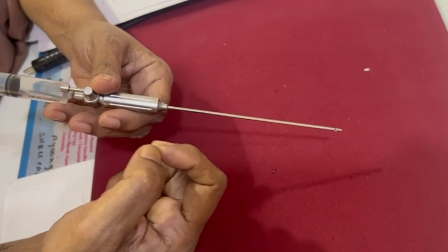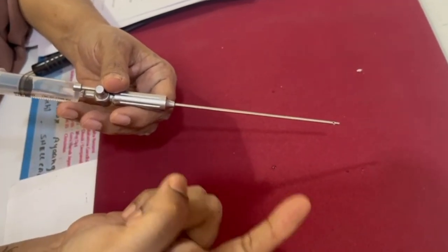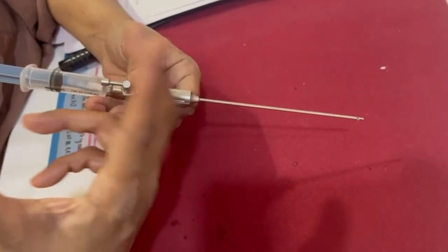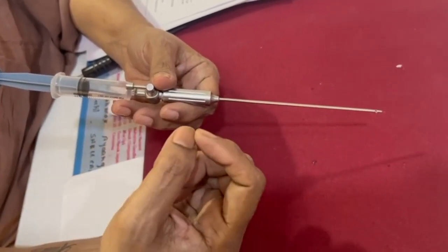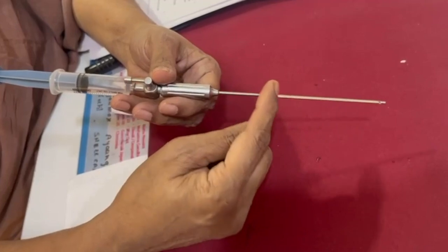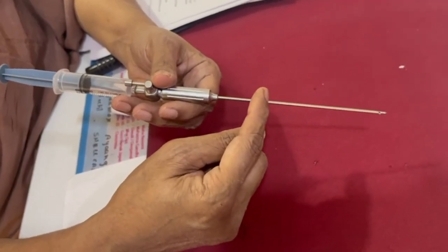Suppose you aspirate blood, that means you have injured a vessel. Suppose you aspirate yellowish fluid, that means you have perforated the bowel. That's the importance of the aspiration test.